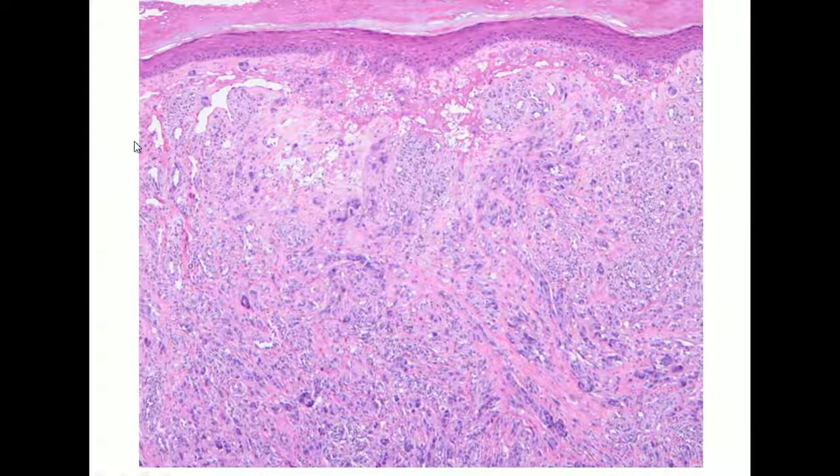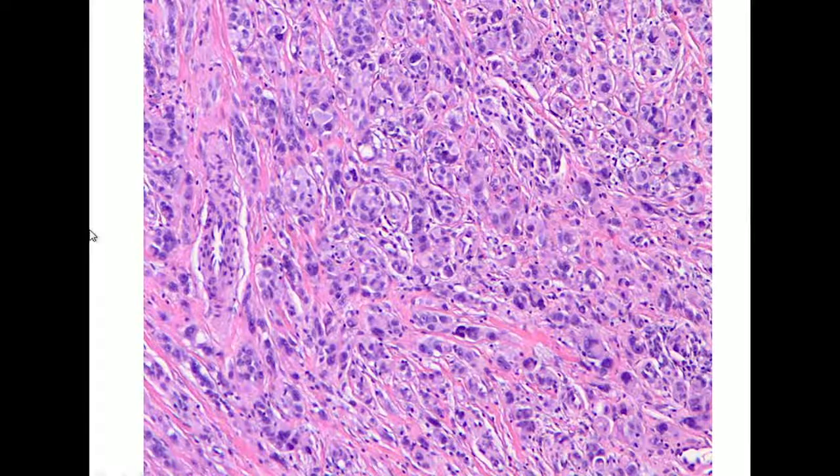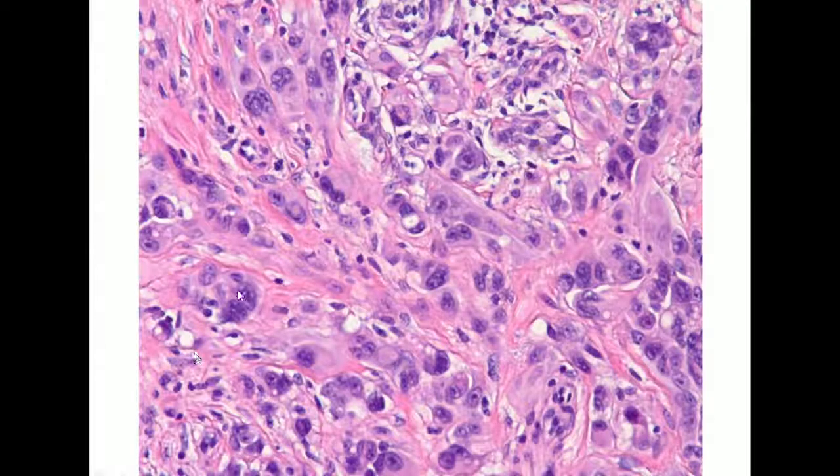Okay, so Dr. Phelps shared an example with me. This is a 13-year-old boy who had a lesion on his knee that we saw at Mount Sinai. You can see that even at this power, there's a lot of atypia. If you look on higher power, you'll see there are these epithelioid clusterings of atypia. And I have a higher power. This is looking scary to me. And it went all the way down to the bottom. Look at Garrett's face. And so it didn't stop.